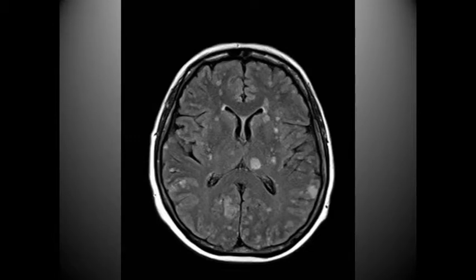Okay, on this image, we're not really getting a patient history or anything like that. However, we do see that we have all of these spots inside the brain, which is kind of alarming in itself.